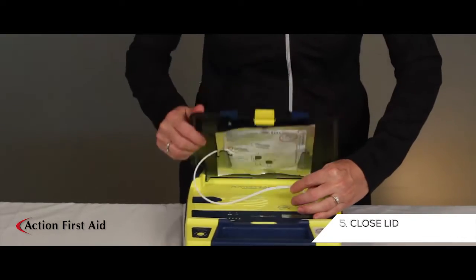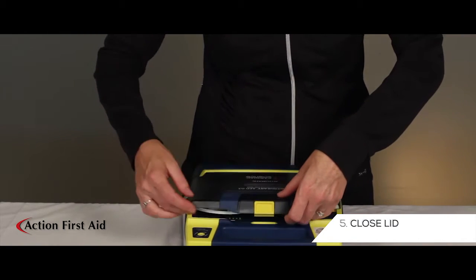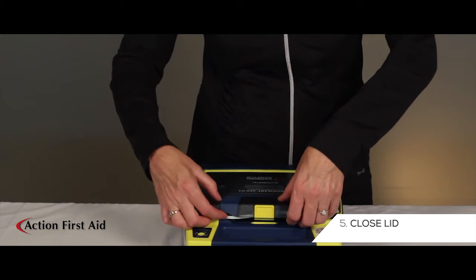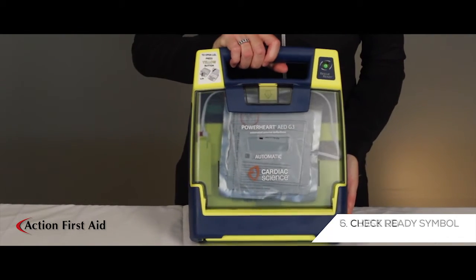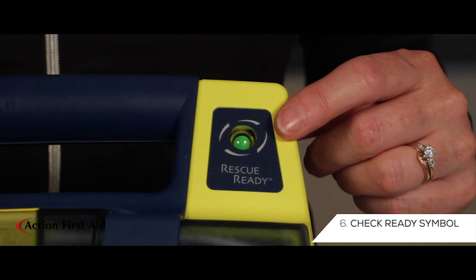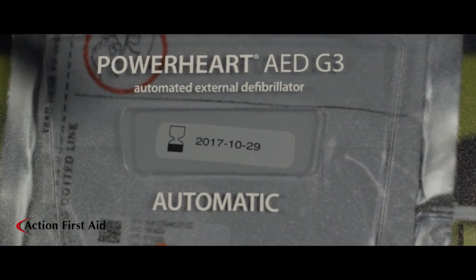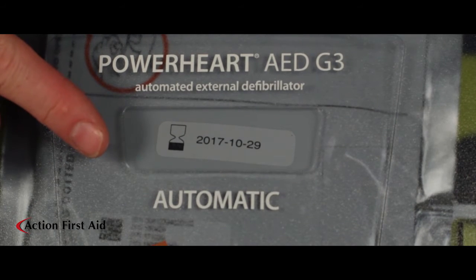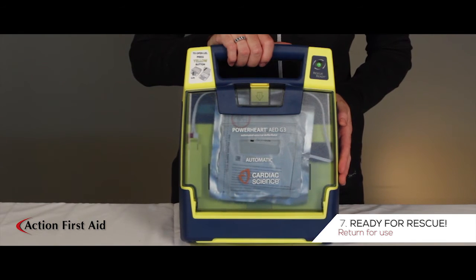Close the lid. Check to ensure that the green Ready symbol is visible. When the pads are installed correctly, their expiry date is visible through a window located on the lid. Your AED is now ready for rescue.